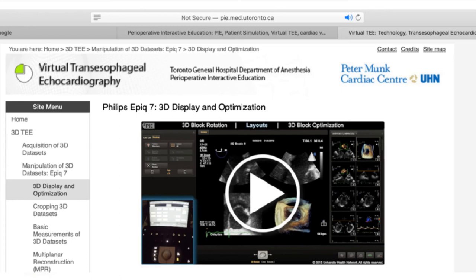Finally, we can change the combination of colors used to display the image. This is sort of the standard combination of colors that most of us use and find useful to interpret the image, but it can be changed. Here we change to a different setting using just one color and different shades. As you saw, with the Philips system you also have the option to make it look like real tissue, which is called TrueView, and the software is loaded on the new machines here.